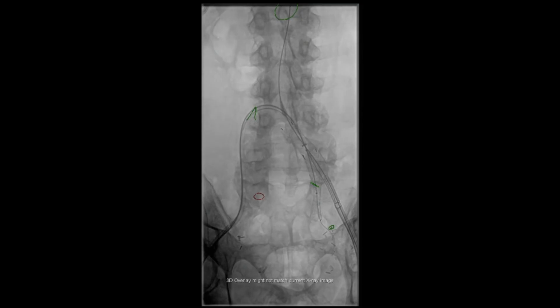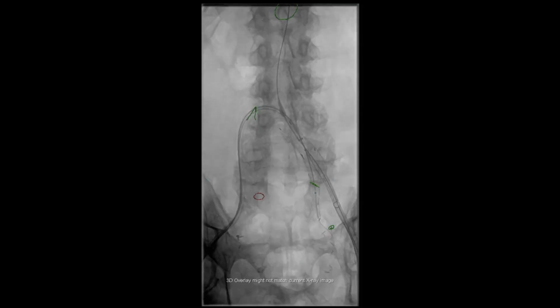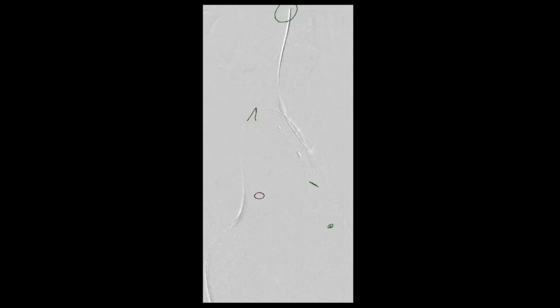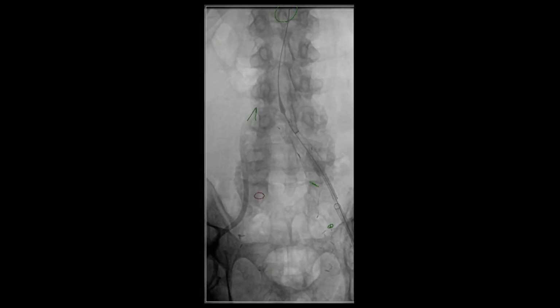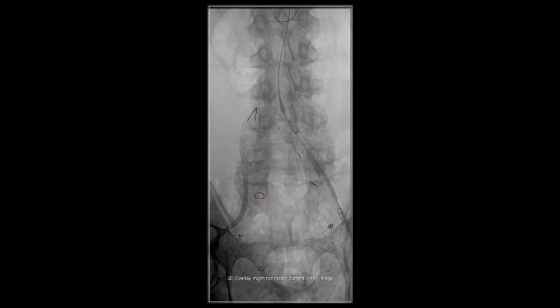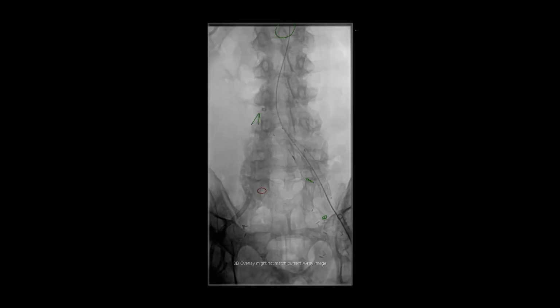Balloon angioplasty of this internal iliac artery stent graft is then performed to make sure proper apposition of the internal iliac artery stent graft to the walls of the artery. Angiogram is then performed to make sure good blood flow to the internal iliac artery and successful deployment of the stent graft. We then completed our deployment of left common iliac artery branch device. Balloon angioplasty of the iliac branch device is then performed.